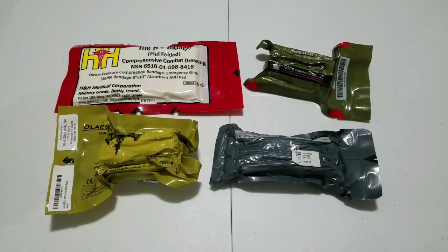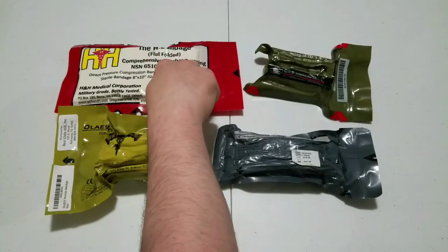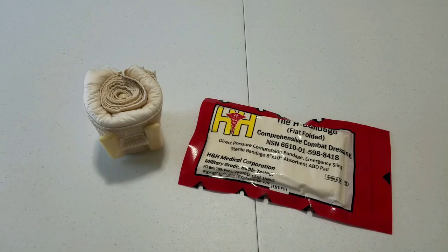Today we are doing an informational video on the H&H H Bandage. The H&H Medical H Bandage is one of the newer pressure dressings we are looking at in this 4-part series. It is newer than the Israeli Bandage and the North American Rescue ETD. I don't know if it is newer or older than the OLAES, but regardless it is one of the newer of the 4.